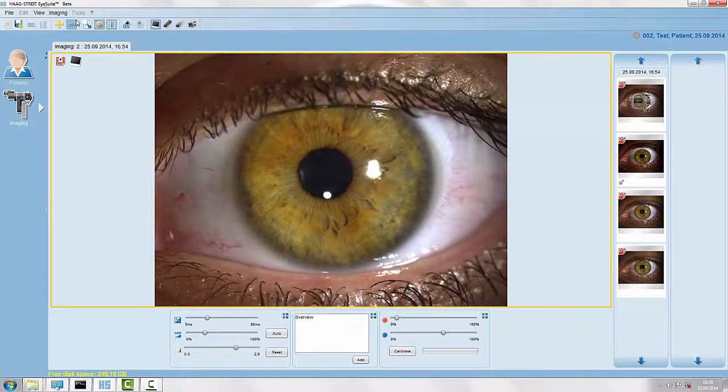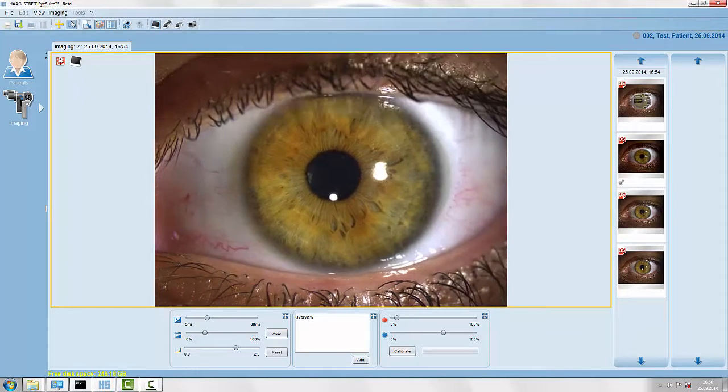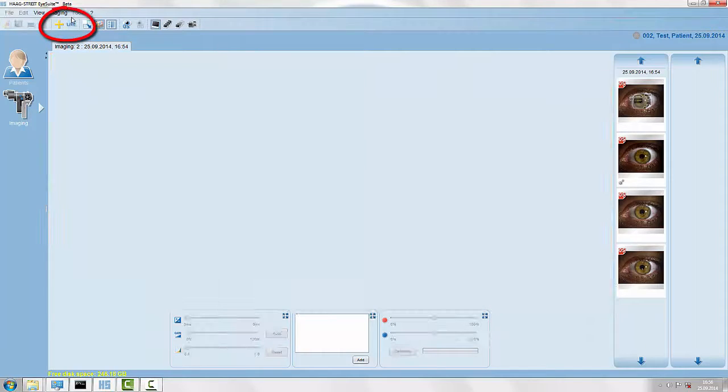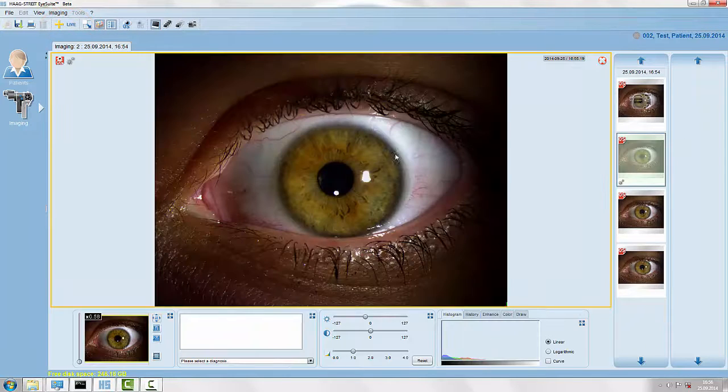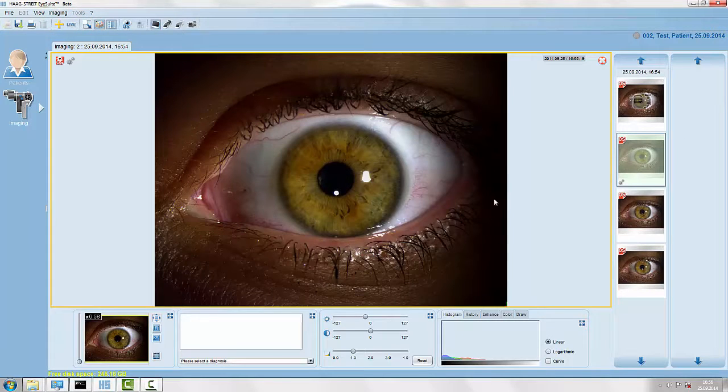Once we have all our images we quit the live mode and are now in the imaging viewer.